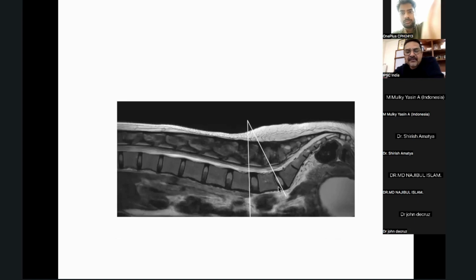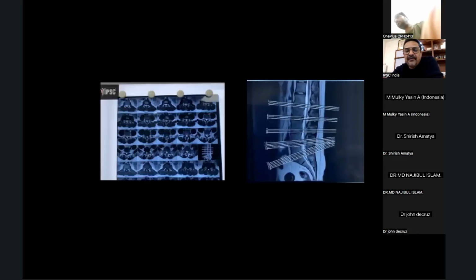Most of the people we have seen just go AP and they start taking the angulation from the lateral. We can use the angulation of the fluoroscope. We can parallelize the end plates. That is another method. Normally, I do that only, because whatever we are seeing on the MRI is basically based on these angulations. They have already taken this parallelization into consideration.